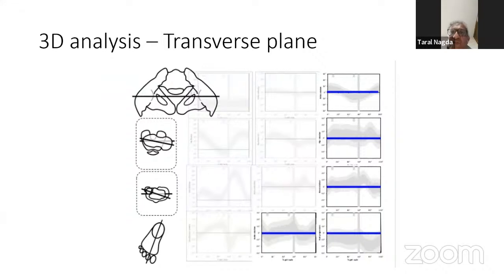So if from a left side shot video, you are able to see a marker on the right side, and if you take the difference, because every video is a 2D plane, right, if you calculate the distance between the two markers, it gives you an indication of rotation of the hemipelvis. And the same thing for the video which is taken from the right side.